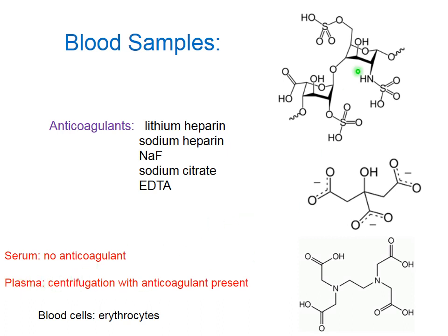So we add anticoagulant and do centrifugation. Or is it receiving plasma stabilized with anticoagulant? This plasma can be stored for a reasonable time and then analyzed.